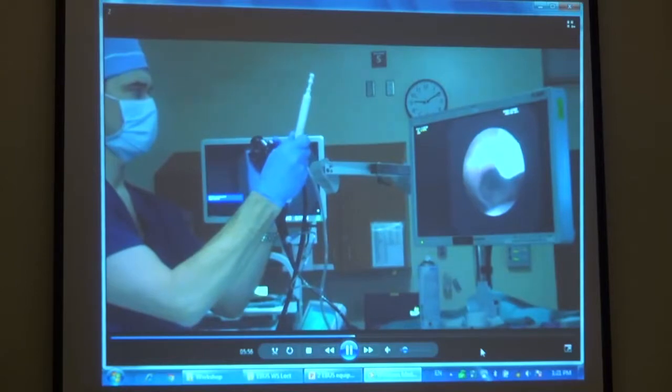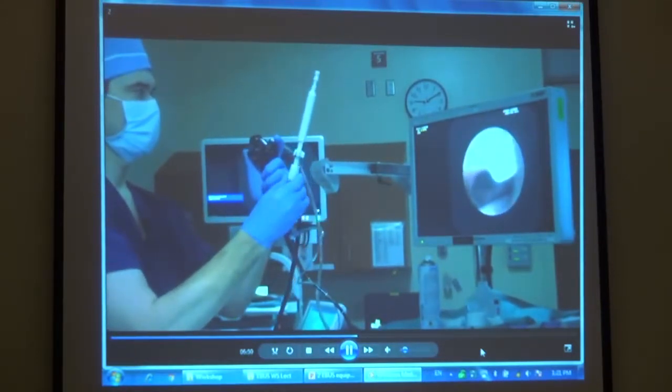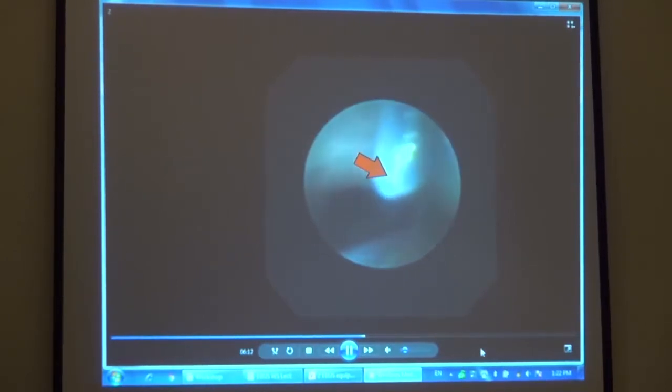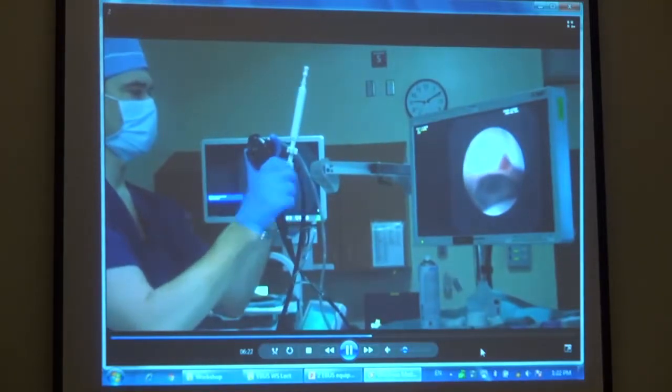As it advances, a subtle downward dip or deflection of the sheath will occur. At this point, the needle tip lies just behind the end of the sheath, and further advancement of the needle will not cause any more of the sheath to be pushed out of the bronchoscope. With the needle and sheath in this position, the sheath can then be carefully retracted back into the bronchoscope, the needle along with it, until the tip is just visible in the white light image. The needle is now set, and the target node can be located again using ultrasound.